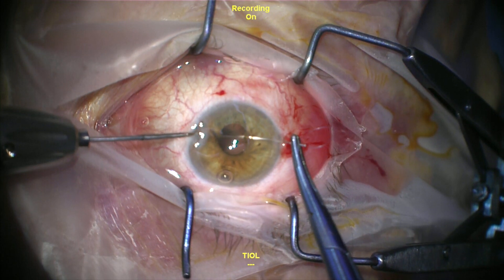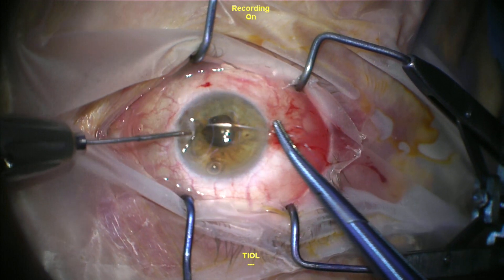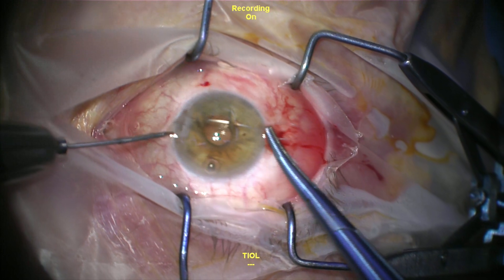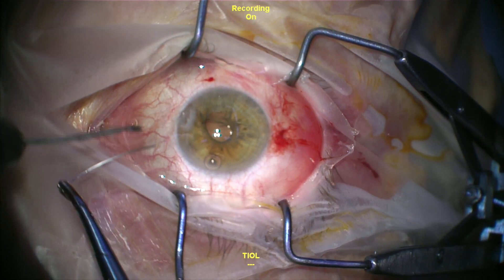This is the first pass of the needle. It's very important to try and achieve a nice round pupil with this first pass. The eye is full of viscoelastic — in this case I've used Helon 5 to make a nice formed anterior chamber and to keep the anterior chamber nice and stable whilst I perform the suture.